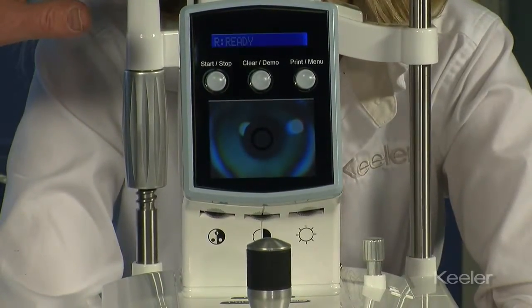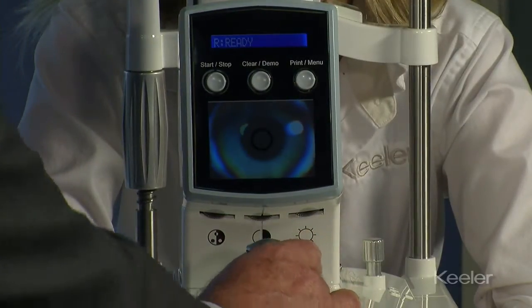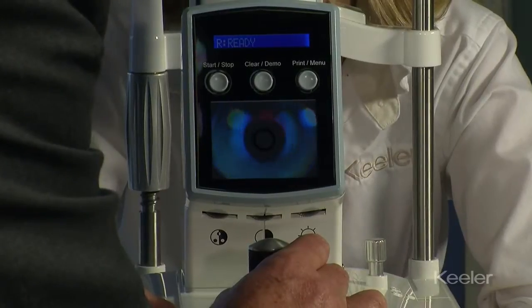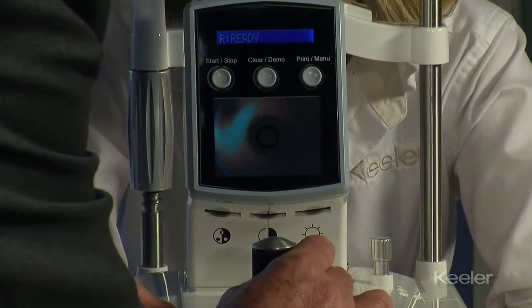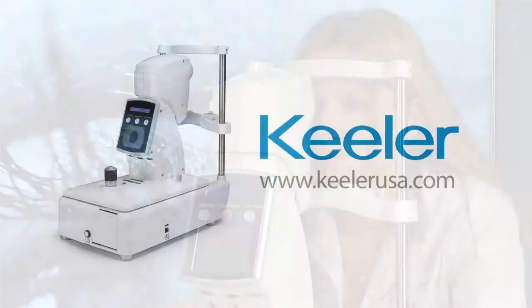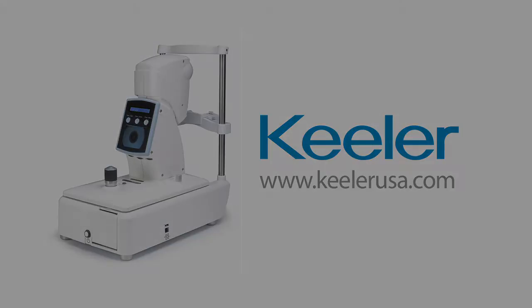Once you have the patient aligned correctly as previously mentioned, fine tuning of the height of the pupil on the screen is done by adjusting the joystick here, then you simply bring the instrument in. You'll see the crosshairs appear and then the reading will be taken. Thank you very much.